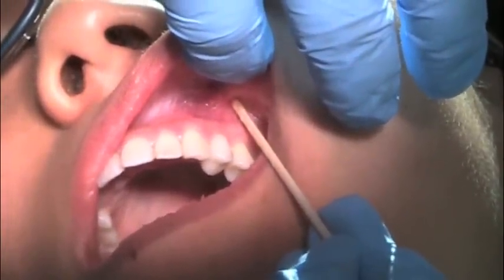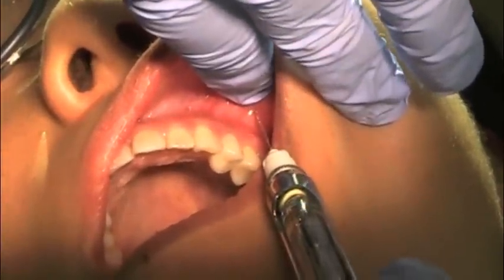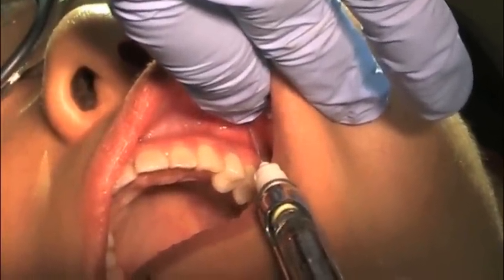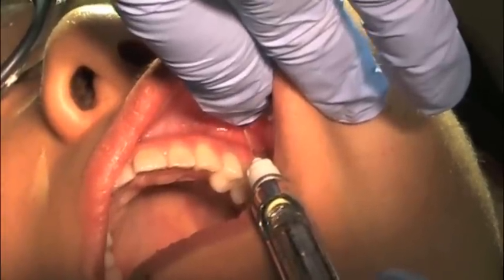Position the needle at the mucobuccal fold above the maxillary second premolar. Keep the needle parallel to the long axis of the tooth. Insertion is just a few millimeters.